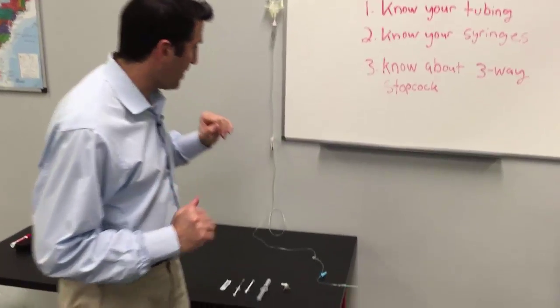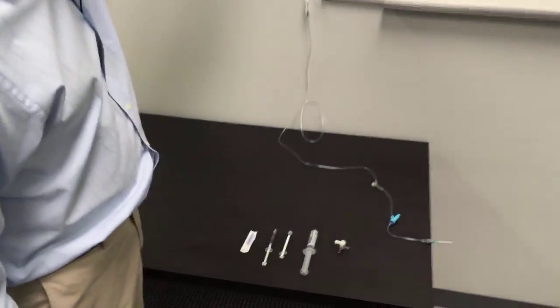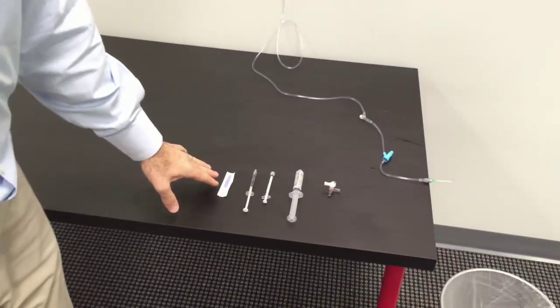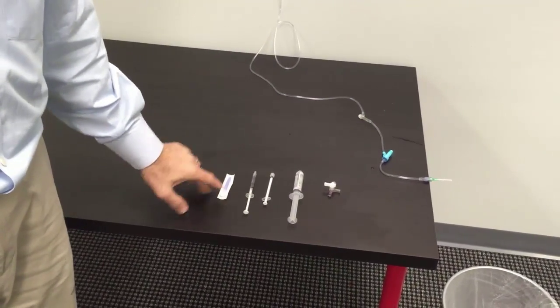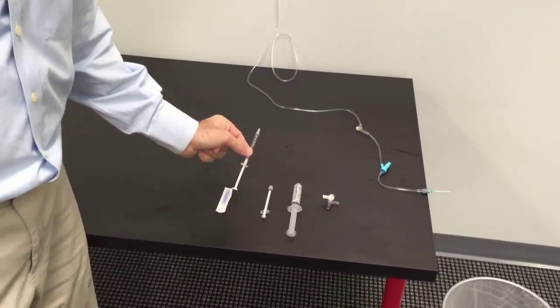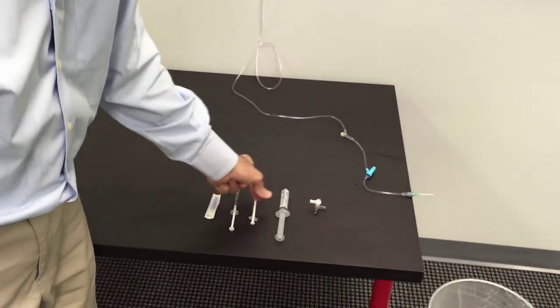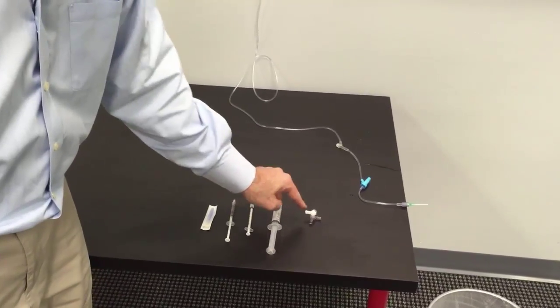Let me show you what I have today — it's all you'll need for adenosine. You have your normal saline bag, your IV tubing, a vial access cannula which I'll show you in a minute, a 1cc syringe without a luer lock, a 1cc syringe with a luer lock, a normal saline flush, and a three-way stopcock.